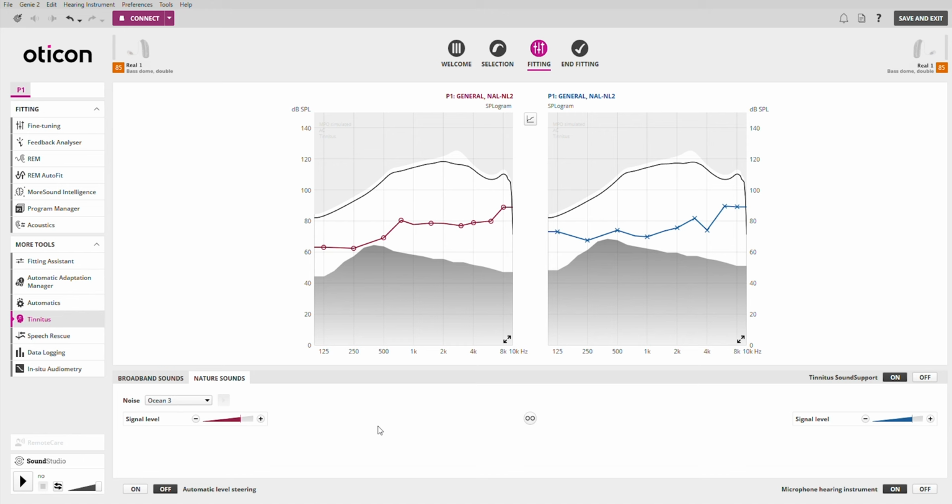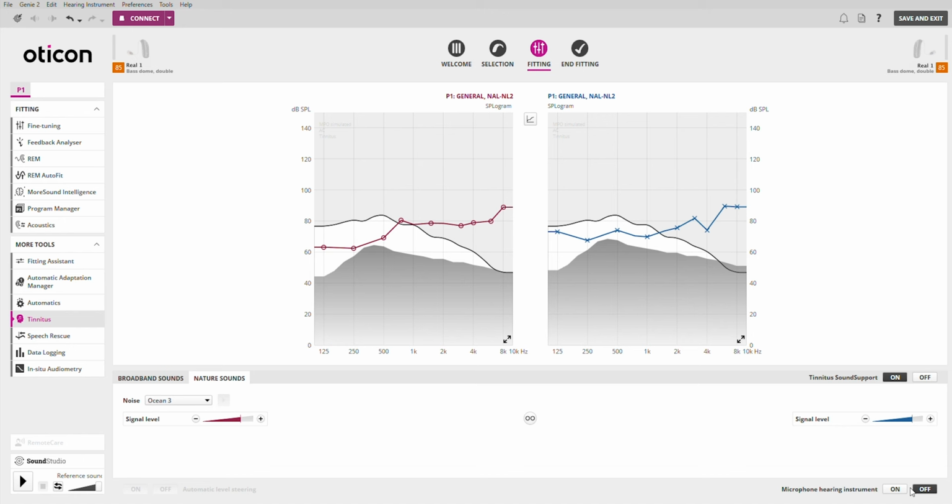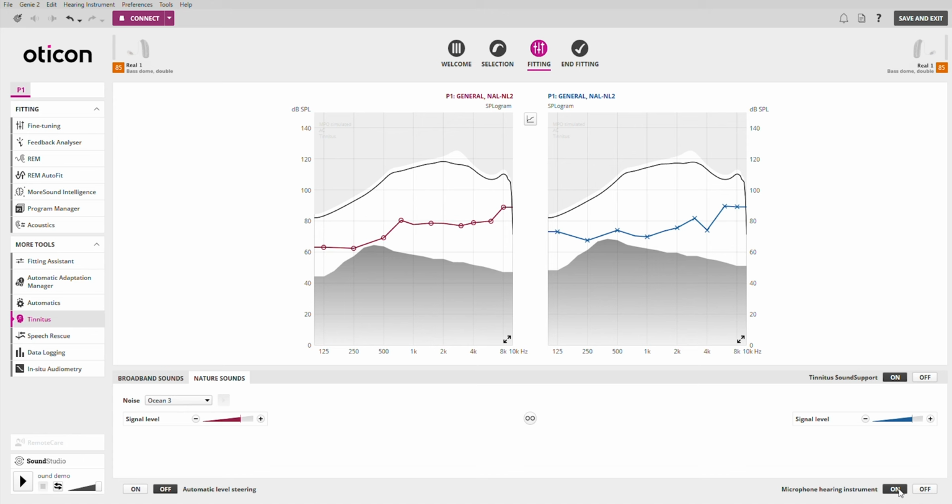As with other hearing aid manufacturers, you can choose the volume of masking to suit your needs. Plus, it's possible to set up a dedicated masking program. In this program, you can decide if you only hear the masking sound or if you want to enable sound from the environment around you as well.